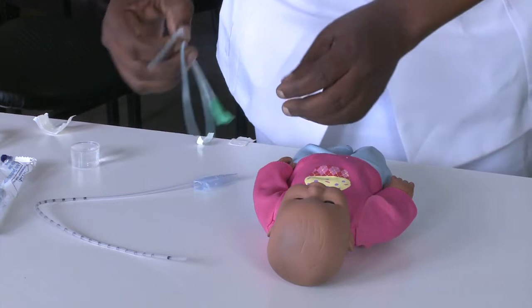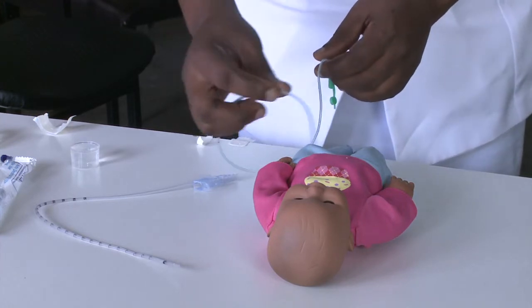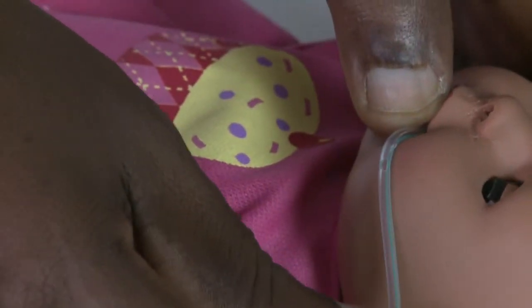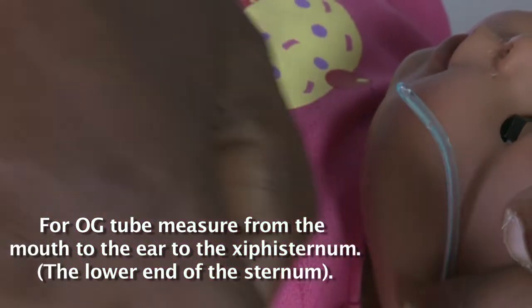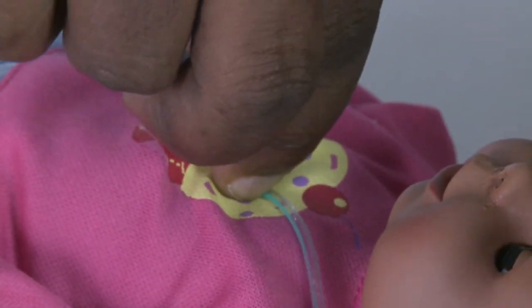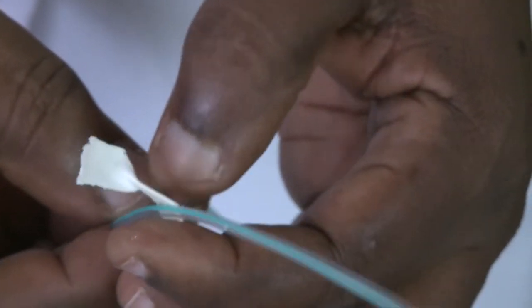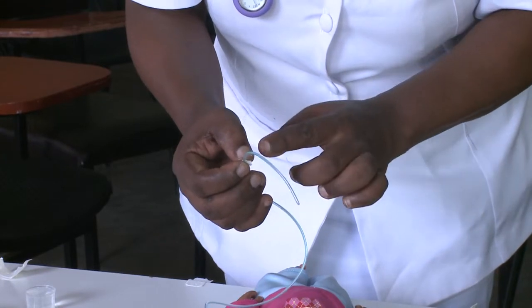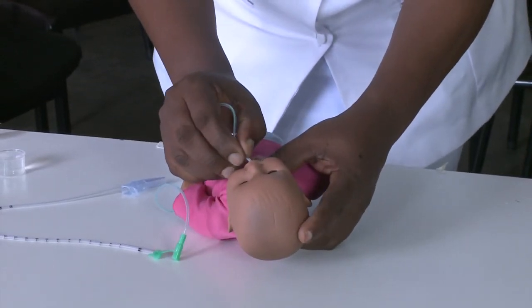I want to put the feeding tube. Since the baby is having respiratory distress, we're going to put this feeding tube in the mouth because the nose will be occupied with the prongs. So I'll measure from the corner of the mouth to the ear, then to the sternum of the baby. I'll mark the length of the tube that I need to insert in the mouth using a small piece of tape to indicate how far to insert.